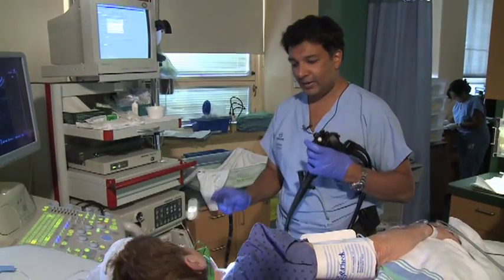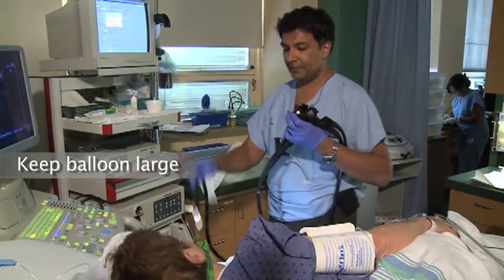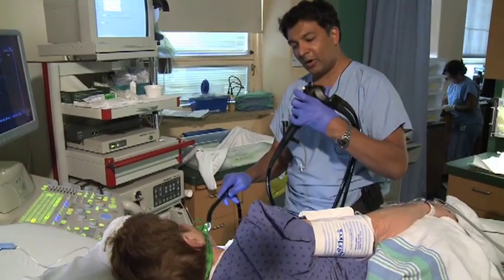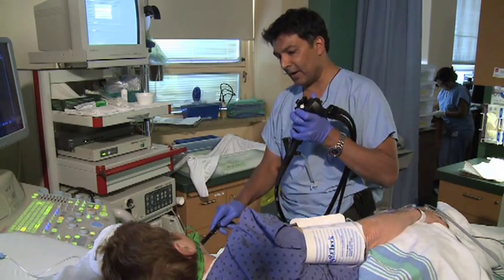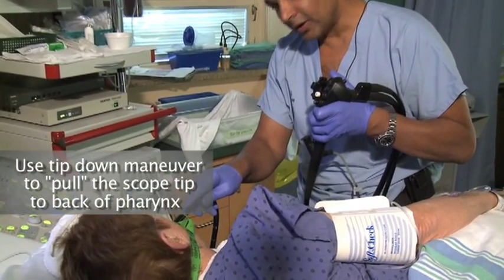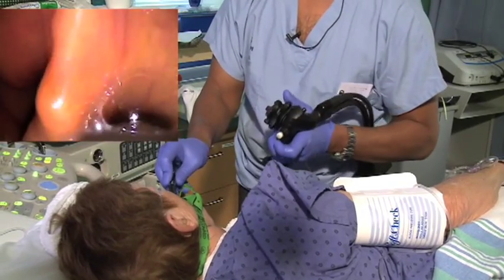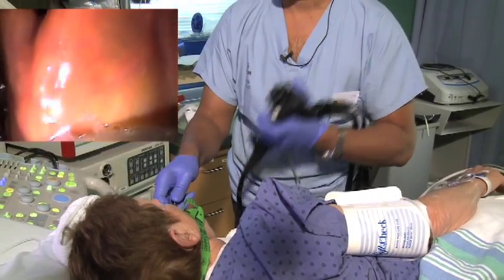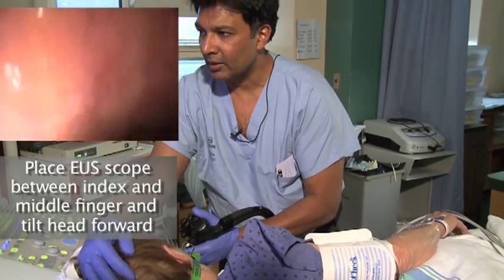To intubate, I keep the balloon up nice and large. I've got some gel on here. We put the scope in the back of the patient's throat, and then we put our tip down — just to pull ourselves back into the back of the throat. Endoscopically you can usually see where you are. So I'm behind the cords; you can just tell them to swallow a bit. If that doesn't work, I put the scope between my two fingers, tilt the head forward, and just push a little bit, and there it goes right in.